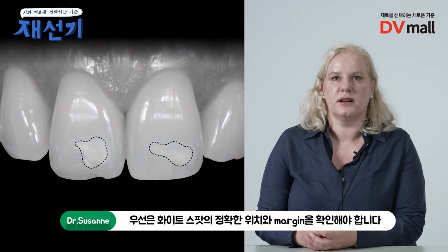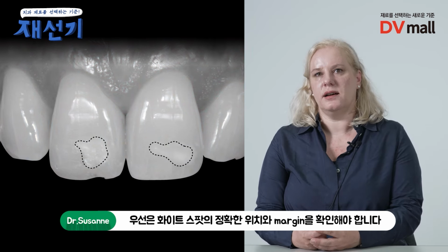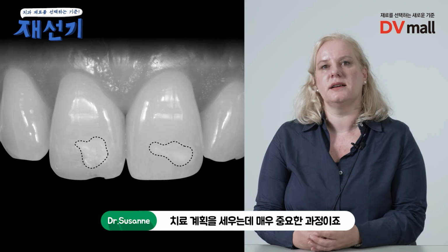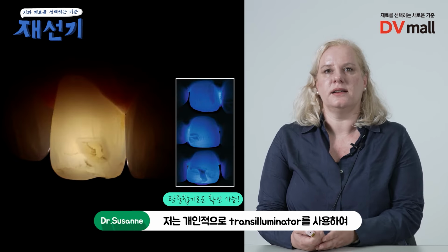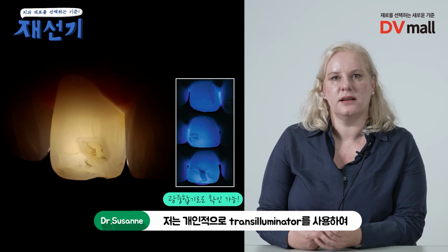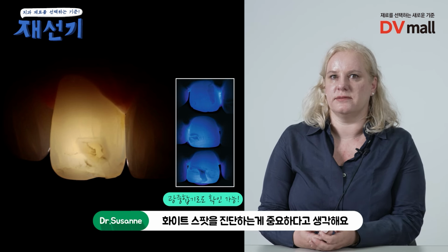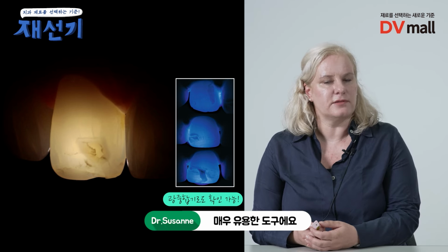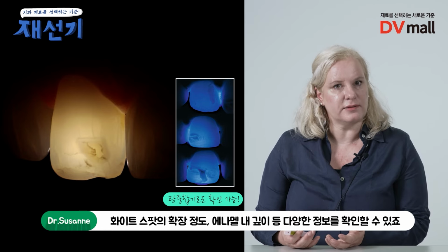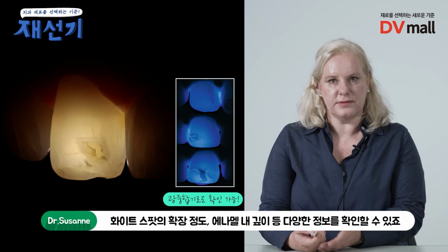aesthetic appearance. So first of all, we identified the lesion and the areas of the lesion, also the margins, because that's a very critical part in the treatment planning. And then in the next step, and this is something that I personally consider a very important step, is the use of transillumination. It's a very helpful tool, and it helps you to understand the full extension of the lesion, the location within the enamel, also the surface quality.